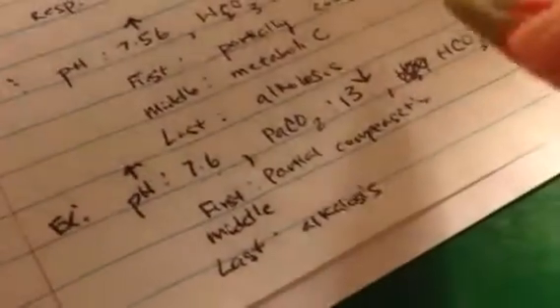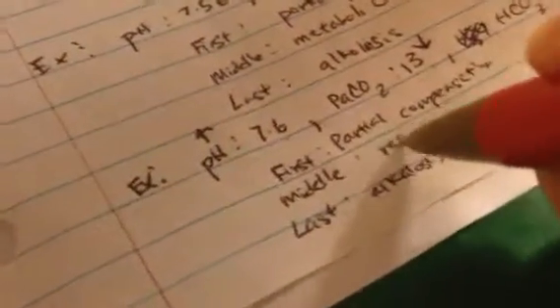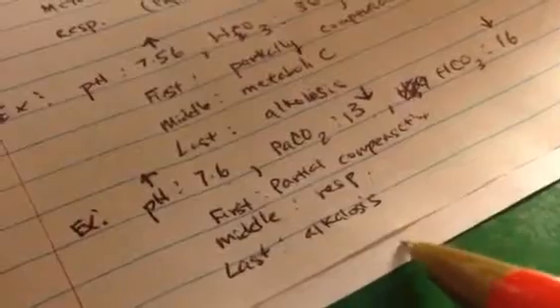We know it can't be metabolic now because it's not an elevator. Both of them aren't increasing or decreasing together. But we know it's respiratory in this case because while the pH is increasing, the PaCO2 is decreasing. So like the seesaw I mentioned, the middle name would be respiratory. So the full name of this person in the land of ABGs will be partially compensated respiratory alkalosis.